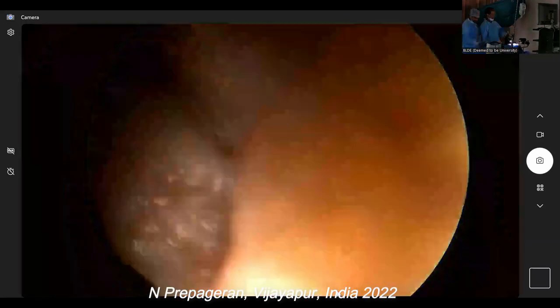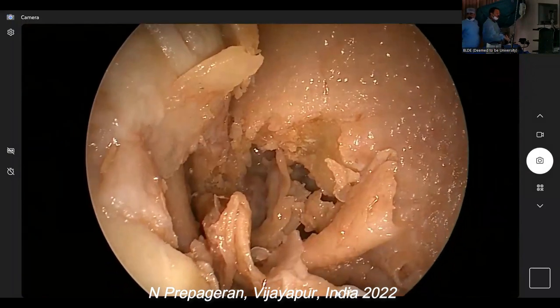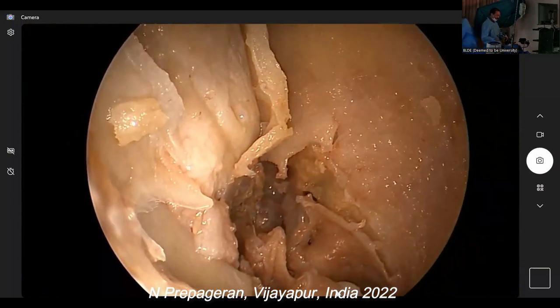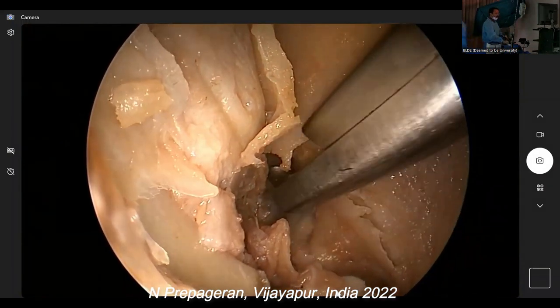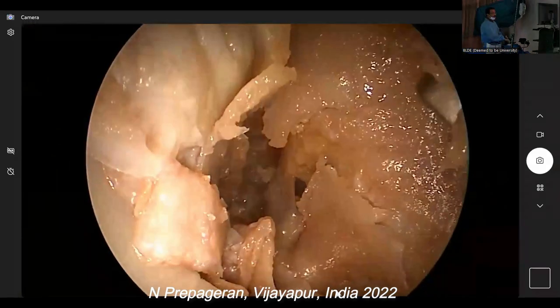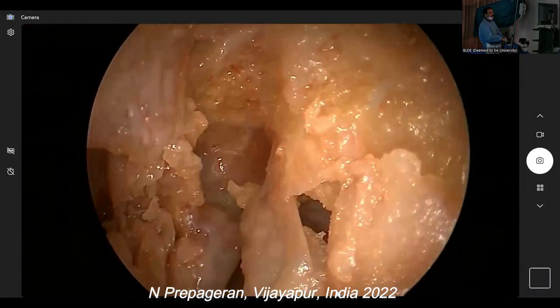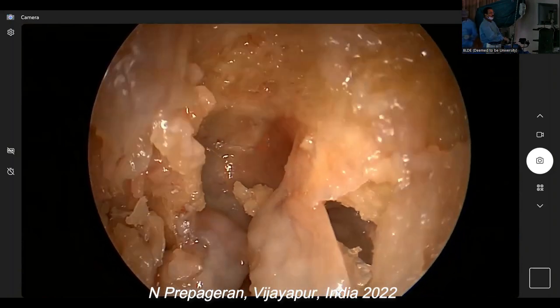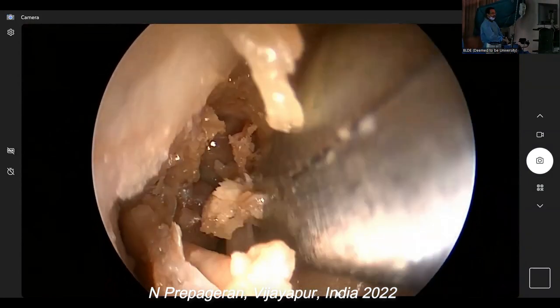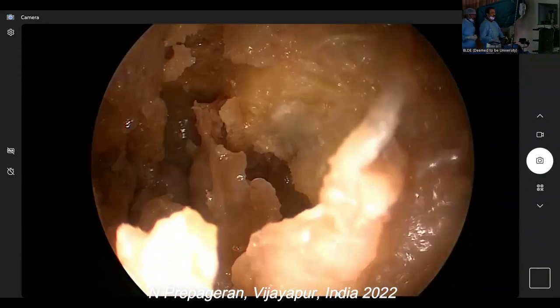Now, Kerrison punch. We need a curved Kerrison punch if you have. So all we need to do is to remove this, and you're removing the anterior wall of the frontal. Sometimes I feel instead of drilling, if you use a good sharp Kerrison or Hajek or cobra, you get into the frontal. Can you see? Yeah? So this guy's frontal isn't so big. Maybe we'll open and see. There's only one way to find out anyway.